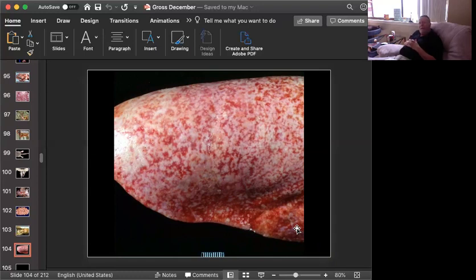Now that you know it's a lung, you can see that it has not collapsed. The fact that it has not collapsed, and we're looking at the caudal lobe of the lung, suggests that this is an interstitial pneumonia rather than a bronchopneumonia. And we have a lot of areas in a sort of retiform pattern which are collapsed, and then you have a lot which are white. It looks like something has been added. Okay, what's been added in this case?